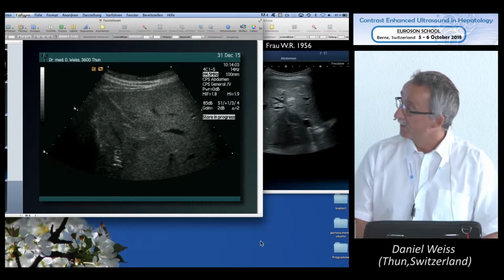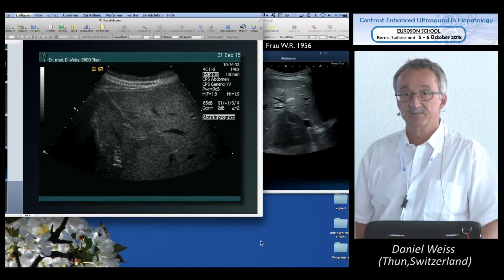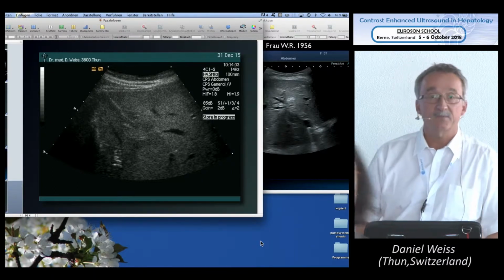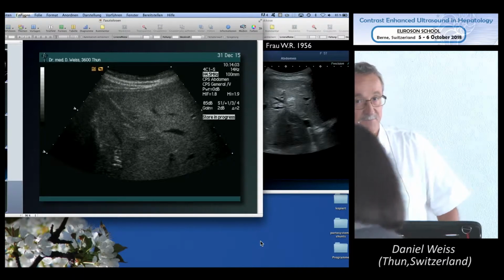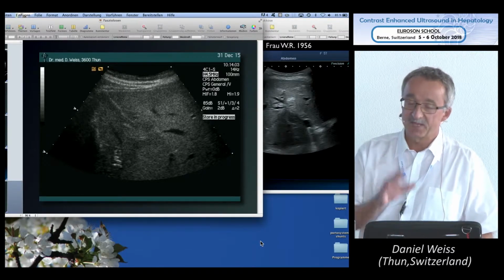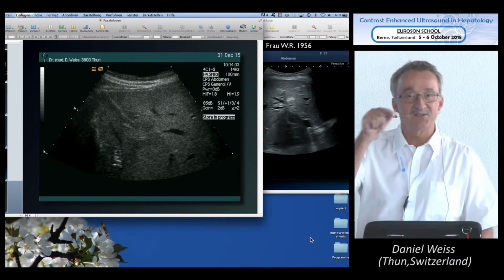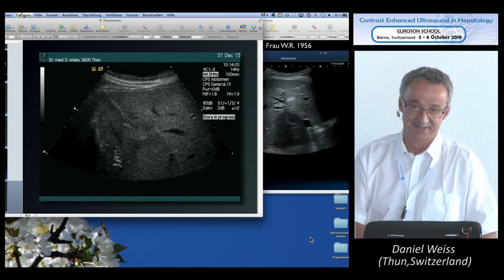So, questions? Maybe? Yeah. In the first case, it was normal. In the second case, I'm not so sure. But the animal died before it could really enter the choledochus.